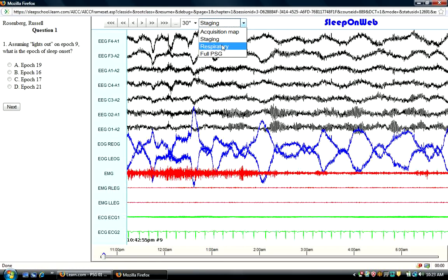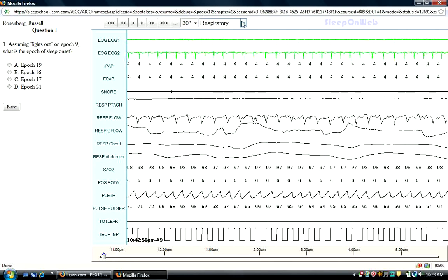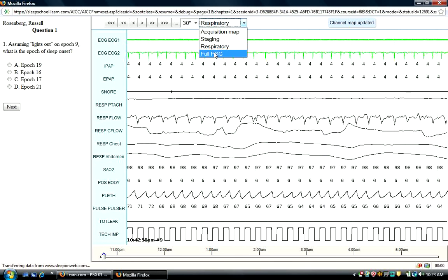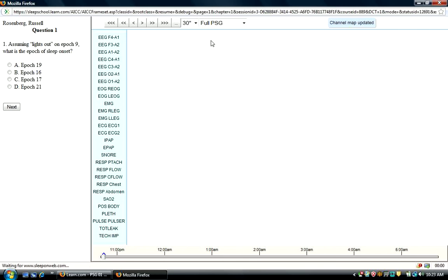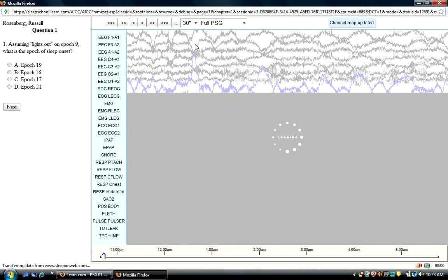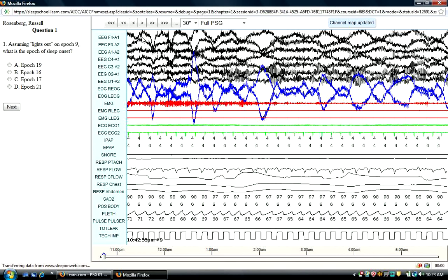If you're interested in the respiratory channels only, you'd click Respiratory. And then finally, we would look at the full PSG, which is the one that I usually look at to go for the whole PSG.